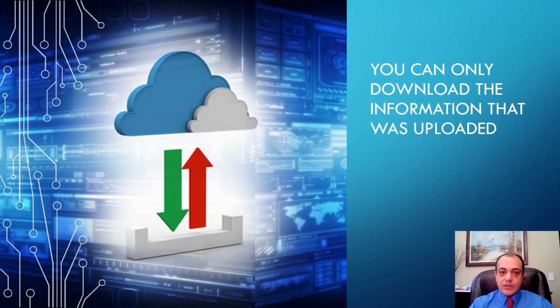The way it works is that the information on the patient's device has to be first uploaded to the cloud. What is the cloud? It is an archive, if you will, a very big computer system that has a lot of memory where you can upload and save the patient's information. Then you can retrieve it or download it from that cloud onto your computer system and view the information in this way.